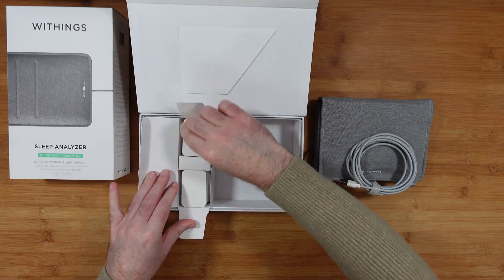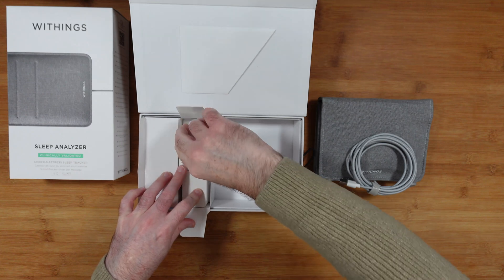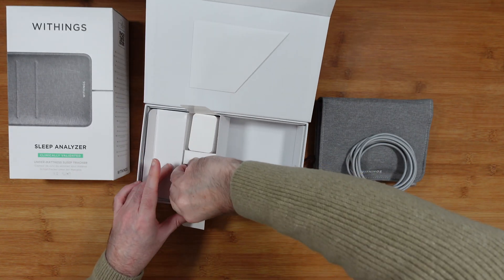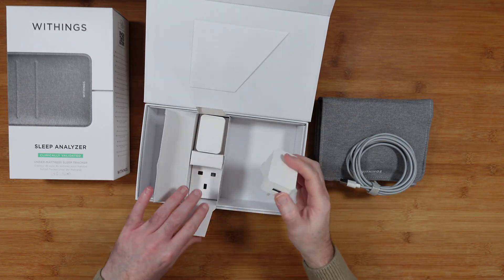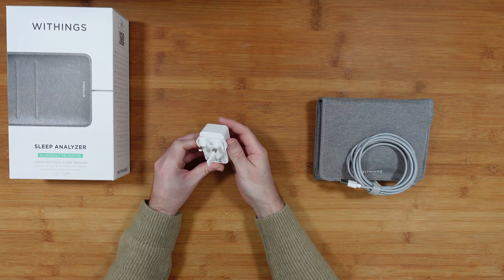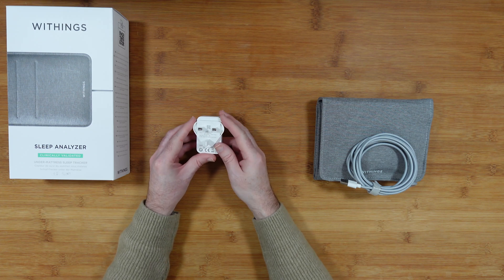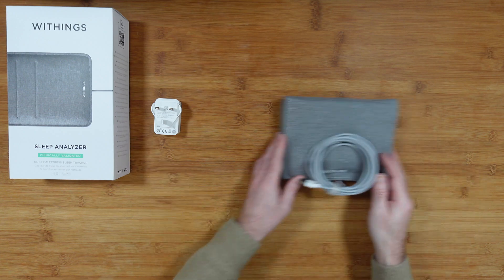In this box I'm assuming we'll find the power adapter — and indeed we have two power adapters: a two-pin Euro power adapter and a three-pin UK power adapter. I thought I was going to have to find my own, but one is included. This is a 100–240 volt, 5 volt, 1 amp adapter.